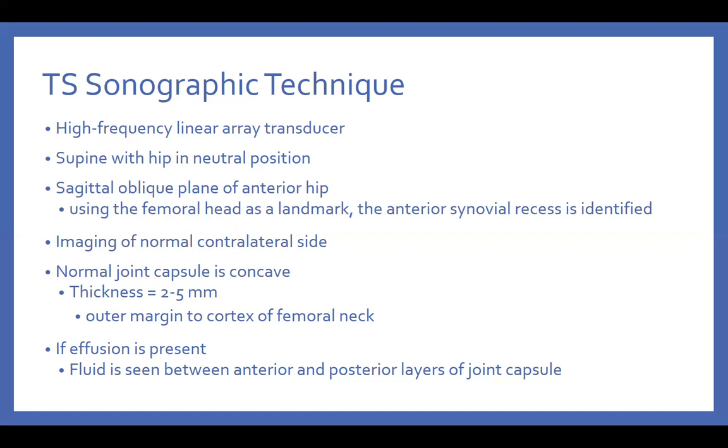Another thing that's important for you and I to understand is whether the child, or whoever the patient is, is able to tolerate some of the pain. I said earlier to put the hip in a neutral position, which is fine. Sometimes a mild degree of external rotation, maybe 10 to 15 degrees of the hip, can be very good. That can give you a better position to evaluate the hip.